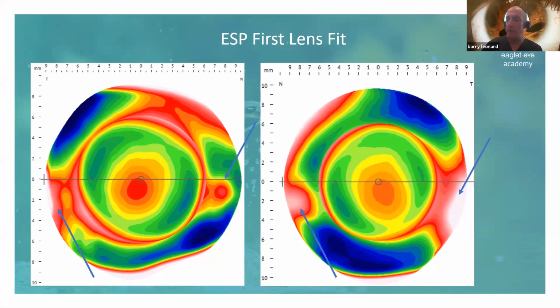What's really good, and Renier was talking about this, my dog just walked in and took my microphone, is that we get these scans, and for me in the real world, the first step is pulling the correct diagnostic lens out of my kit. So we look at the ESP data, and we get the HVID very accurately. I always thought I was pretty good using a ruler and saying that's the HVID, and I found, I guess because of parallax, it was very different than reality.